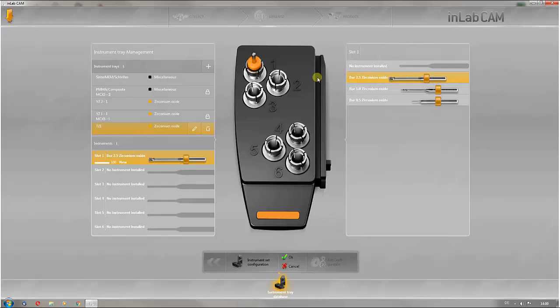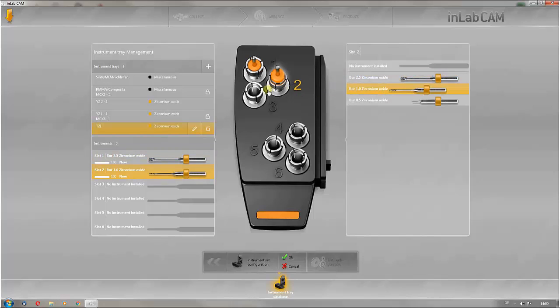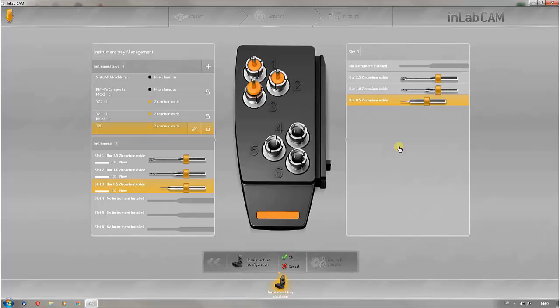In this case, we selected zirconium oxide burrs in the sizes 2.5, 1.0 and 0.5 to positions 1 to 3.